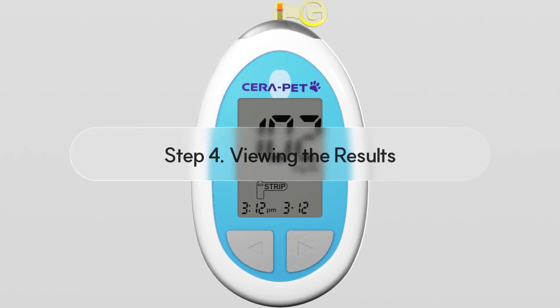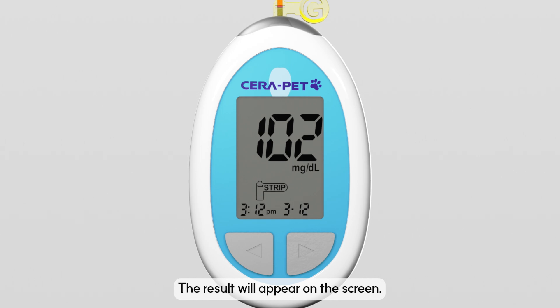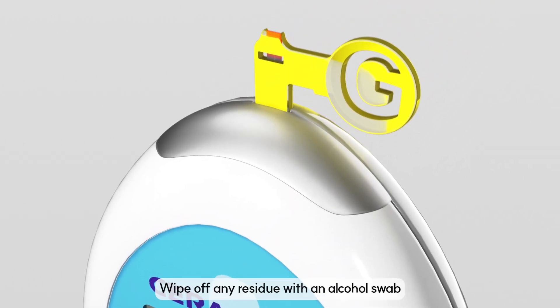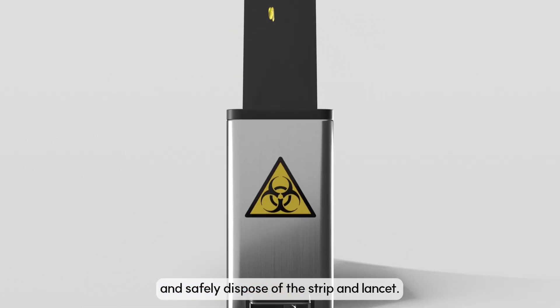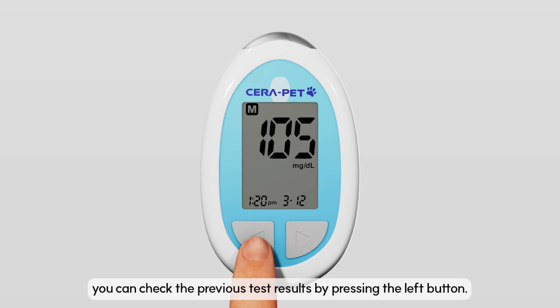Step 4: Viewing the results. The result will appear on the screen. Once the test is done, remove the test strip, wipe off any residue with an alcohol swab, and safely dispose of the strip and lancet. Additionally, you can check the previous test results by pressing the left button.